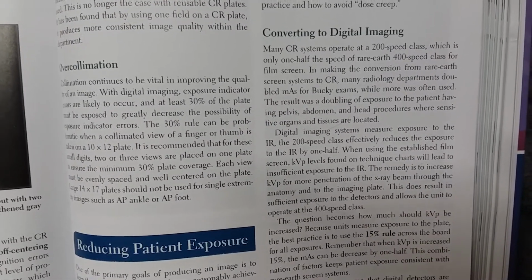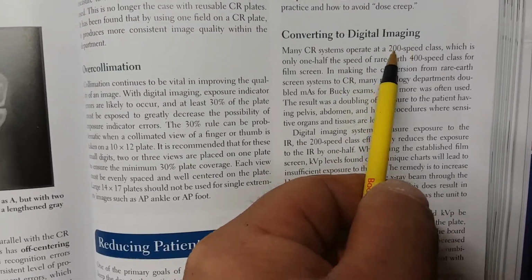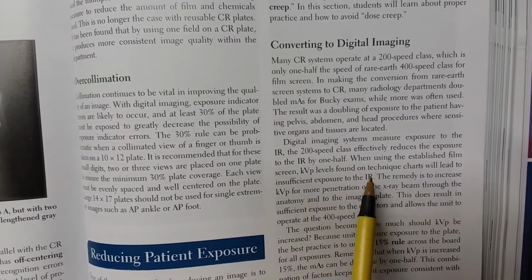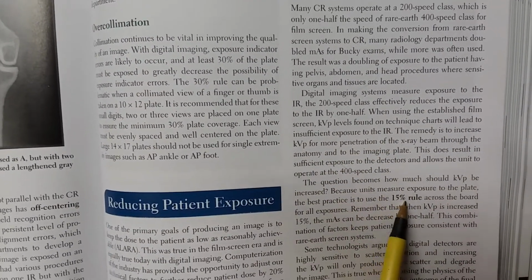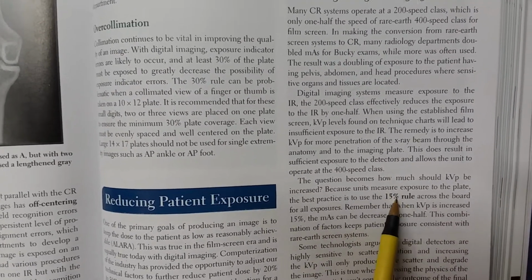So therefore, with the digital systems, you're either going to have to use twice as much mAs as you did with film screen, or the better technique would be to use 15% more kV. Following the 15% rule means that you can use higher kV.